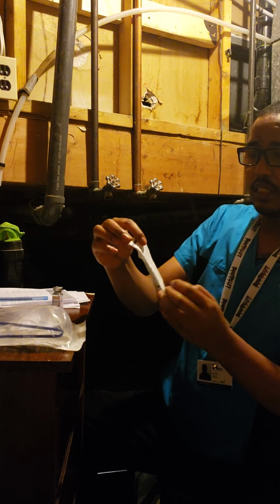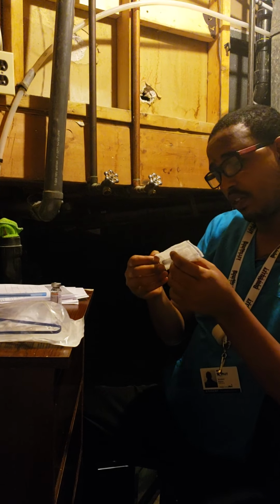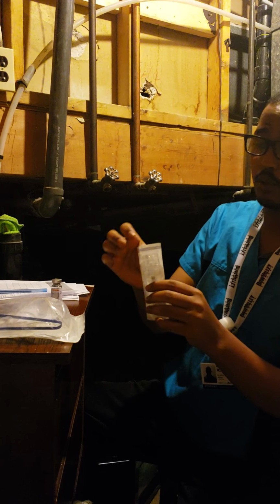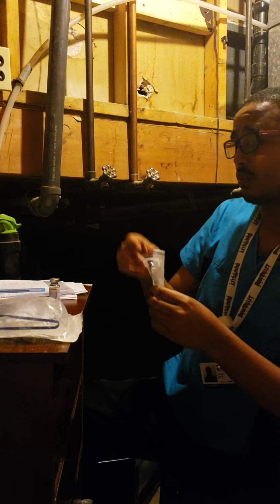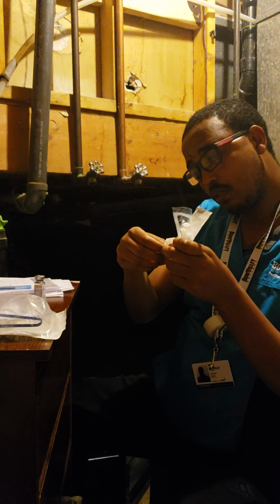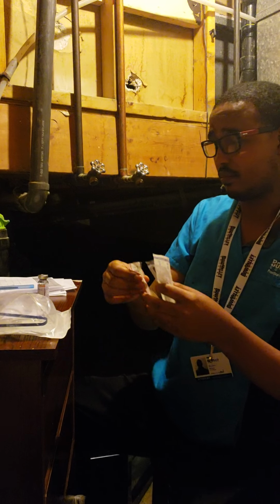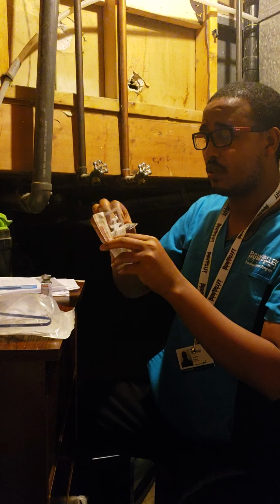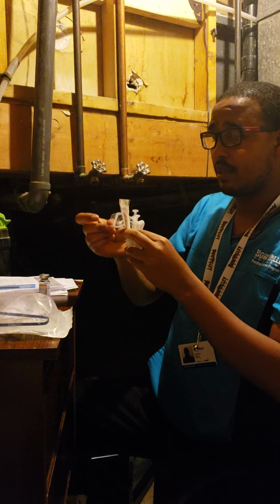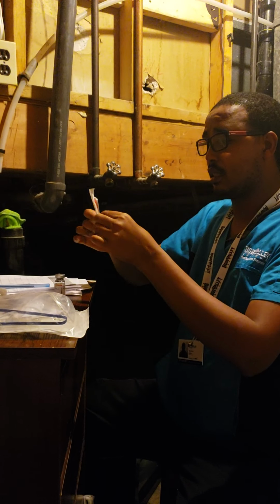Open my syringe. It is a 3 ml syringe. Its expiry date is 2024, and it is supposed to be intact, but I have used it before. And this is the blunt fill syringe. Its expiry date is 2024. It is supposed to be intact, but it is open. I have used it. Okay, so I am going to open it. This is 3 ml because my medication is 2 ml. That's why I select 3 ml.